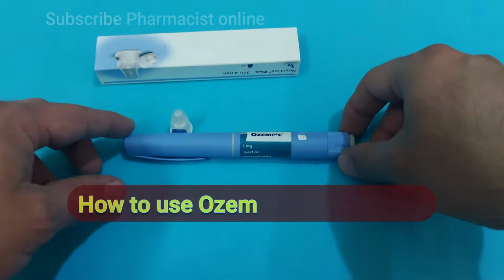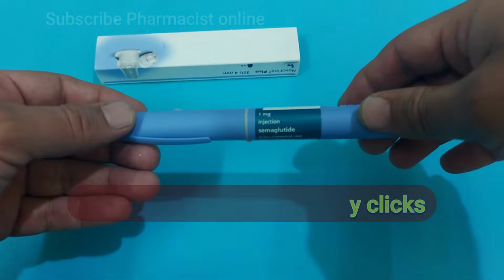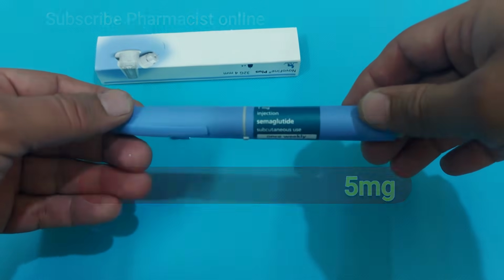Hello viewers, in this video we will discuss how to use the Ozempic pen by clicks. If we want to use 0.25 milligram, 0.5 milligram or 0.75 milligram, we can use this Ozempic pen.